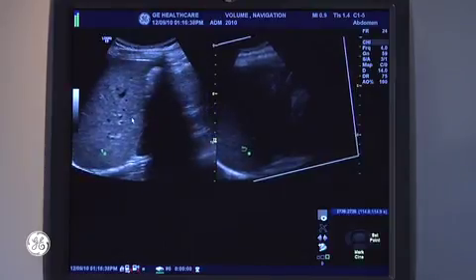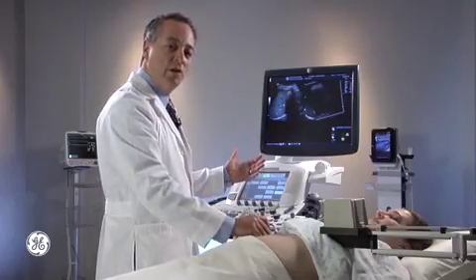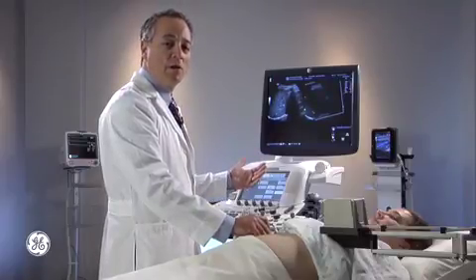So utilizing GPS markers along with my previously acquired ultrasound, volume navigation allowed me to get back to that point with much simpler actions.